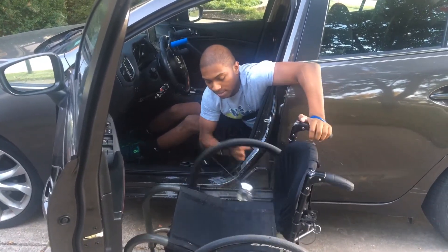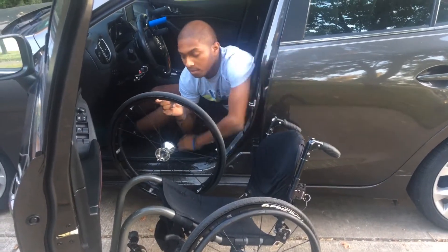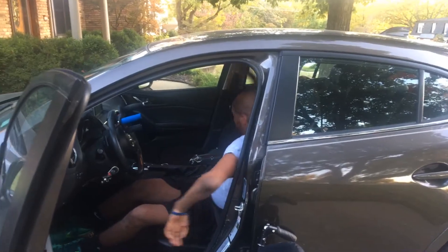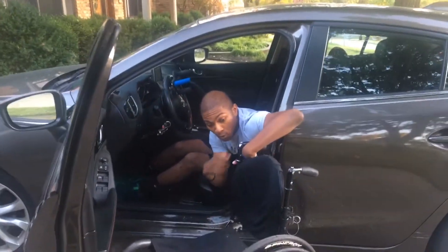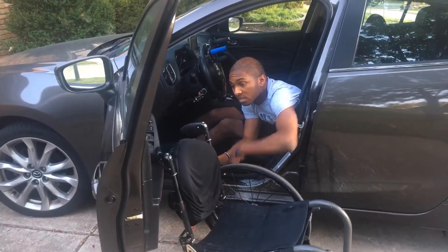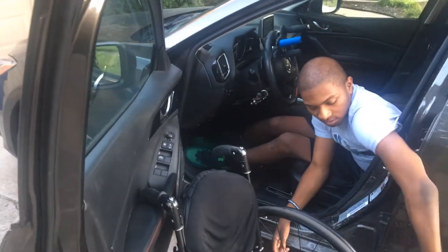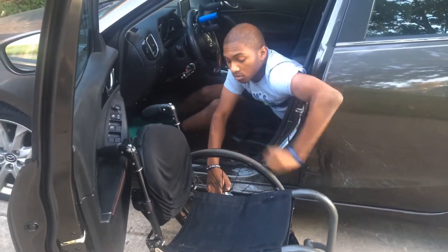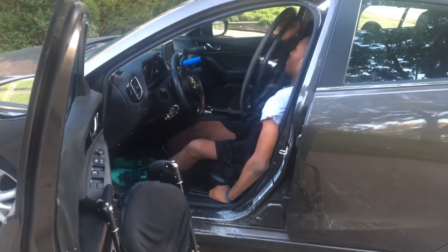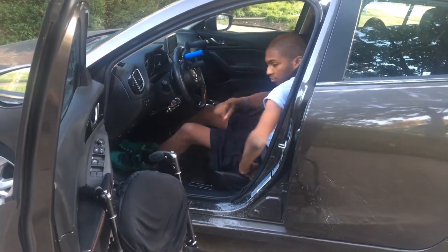Then unlock the chair, take the wheels off — make sure you're holding that at the same time. Place the handle right there, then put the wheels in the back seat. Flip it over towards you so you're seeing it, and place the handles right here so you don't have to hold it.